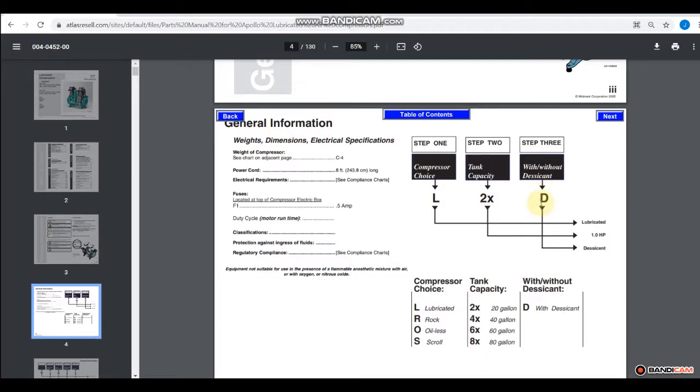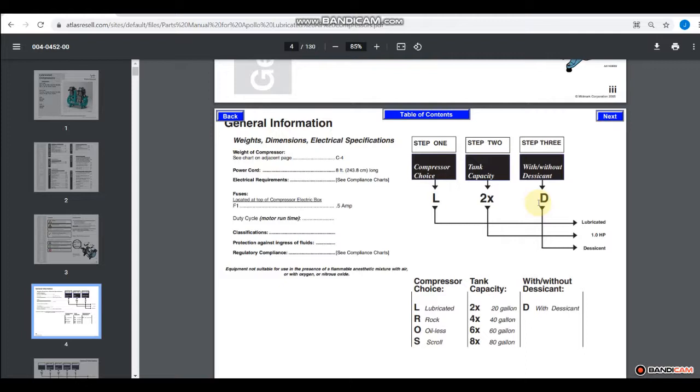Now desiccant, we'll talk about that a little bit later on, but that's basically how moisture is removed from the air. And we can talk a little bit more about moisture in the air, because that's a huge factor concerning air compressors.